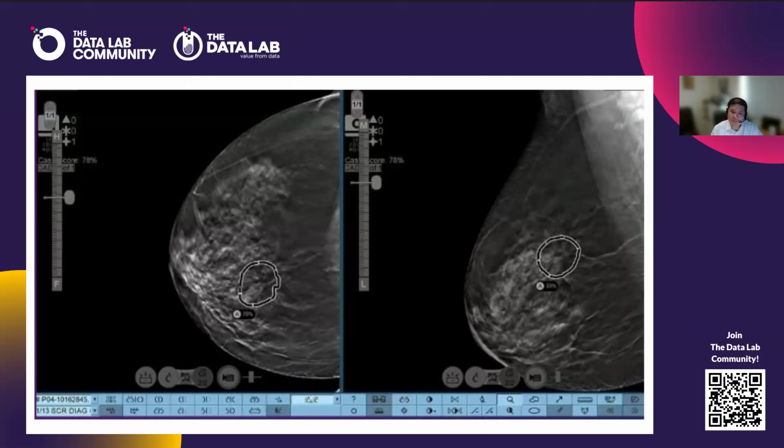The companies doing that are also bringing 3D AI tools, and colleagues in Leeds and Wales are pioneering this work here with 3D mammogram AI. AI in MRI is difficult because of multiple different modalities, so we don't see as much of that.